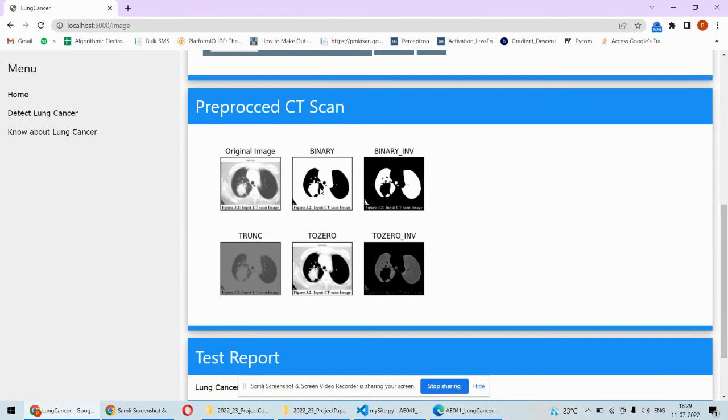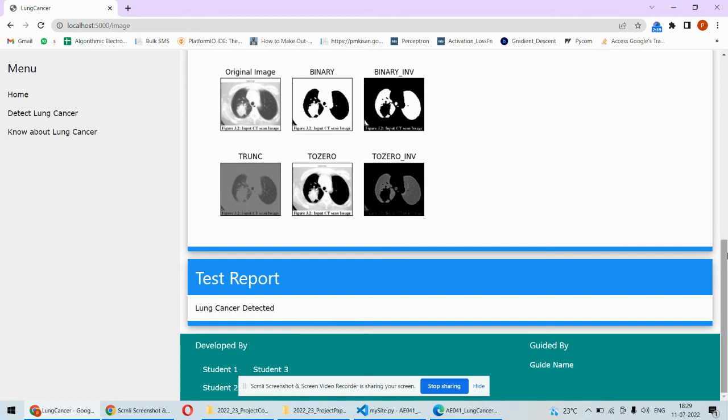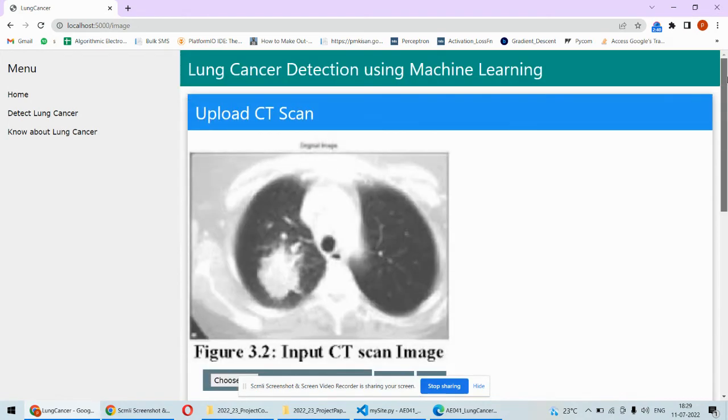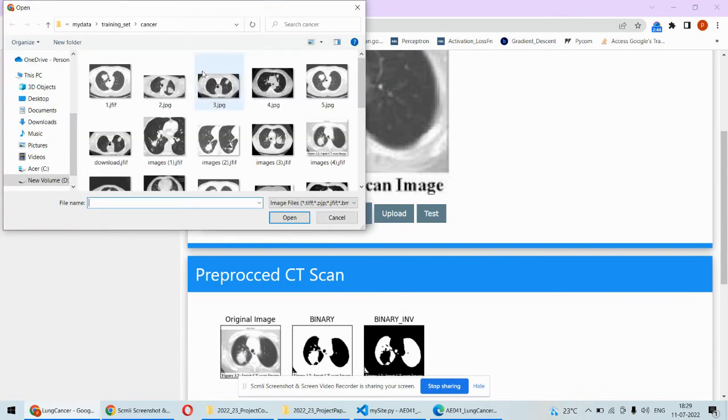So this is the original image and its binary version will be like this. This is inverted binary version, truncated versions, and this kind of preprocessing is happening over here. Based on this thing it has predicted lung cancer detected in this particular image.